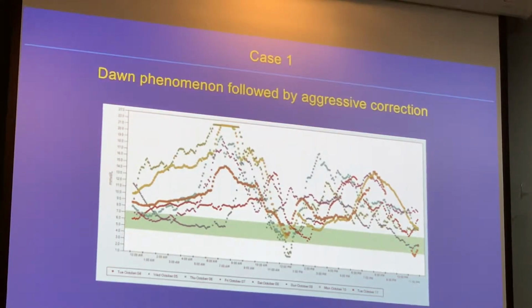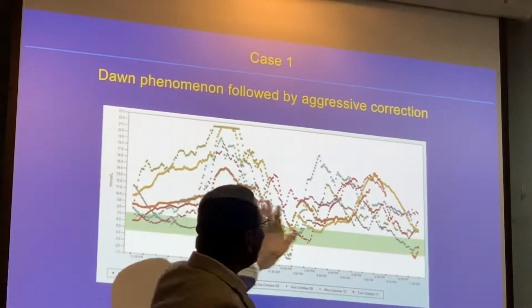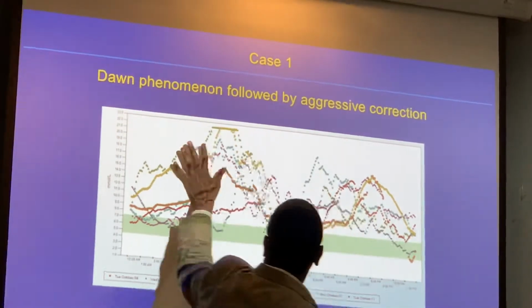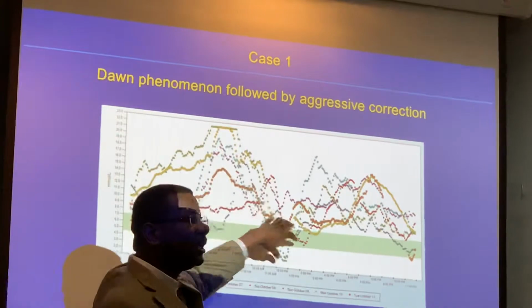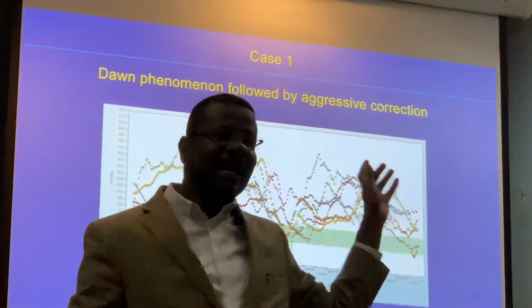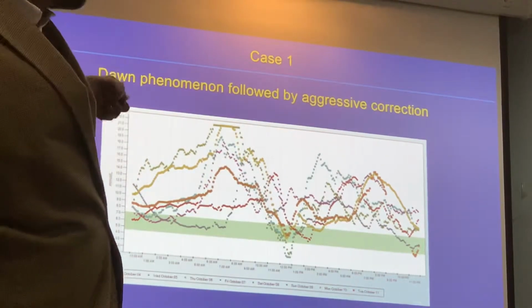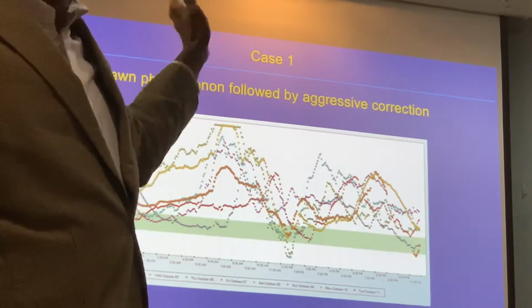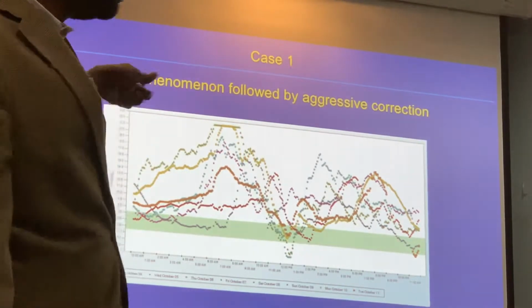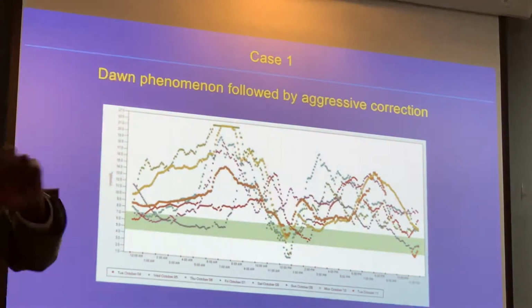Okay, and as I said, once you identify the major abnormality, like in this case, I wouldn't really go talking a lot about other things here because this is the major problem: the hyper in the early hours of the morning and the hypo. So to get marks, I need to quickly say that, and you quickly tell that the patient should be also educated not to overcorrect. That will give you marks. But if you keep talking about other stuff, that will just make you lose marks.